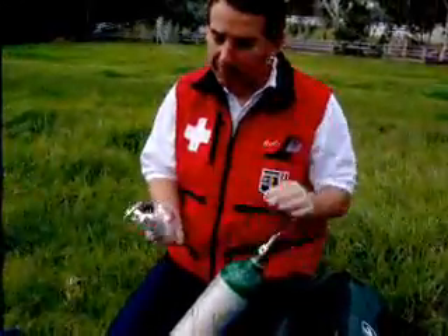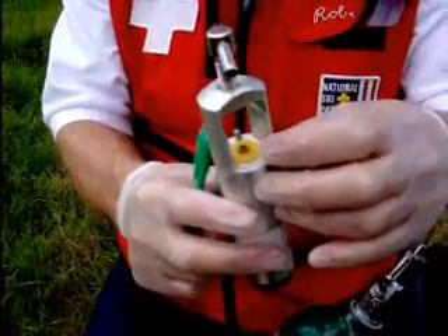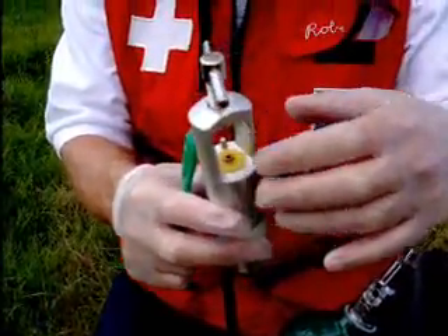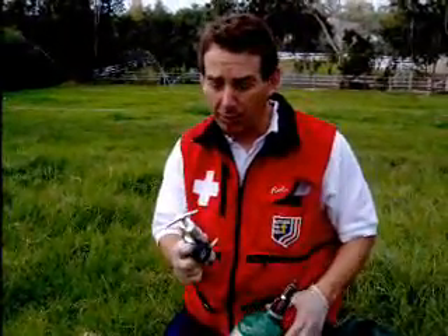Second, you take the regulator. The regulator has an O-ring here that will provide the seal. They can be yellow or they can be black. If the O-ring isn't in there, it won't seal. Lots of patrollers, including myself, carry a spare O-ring with them.